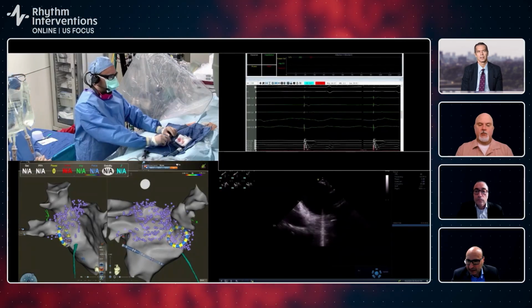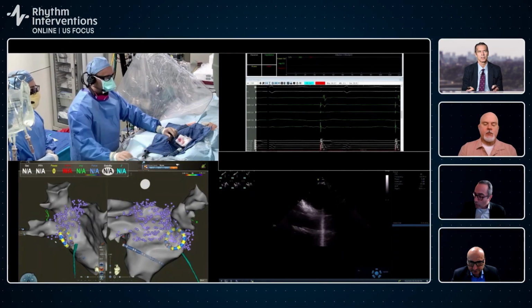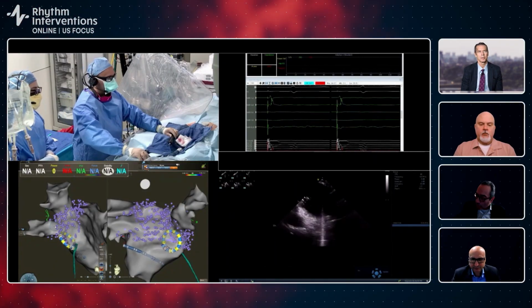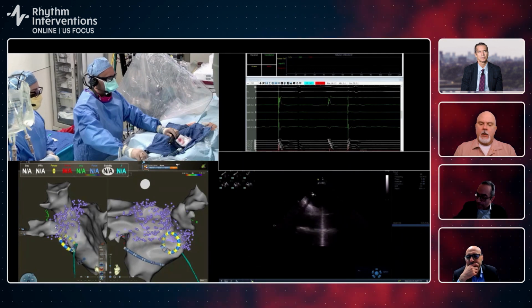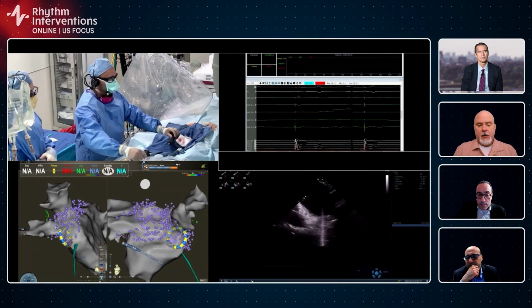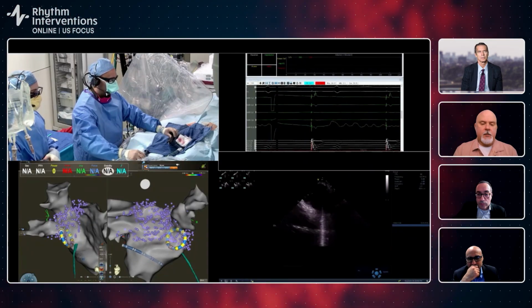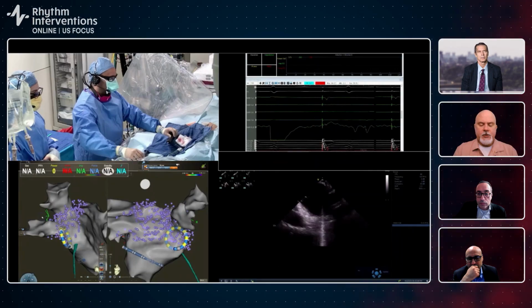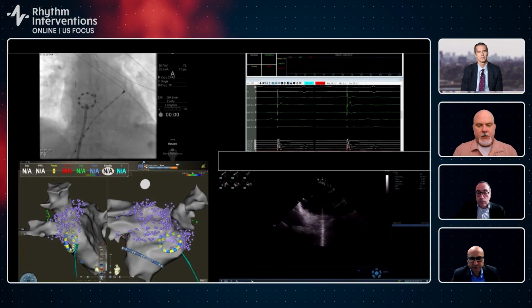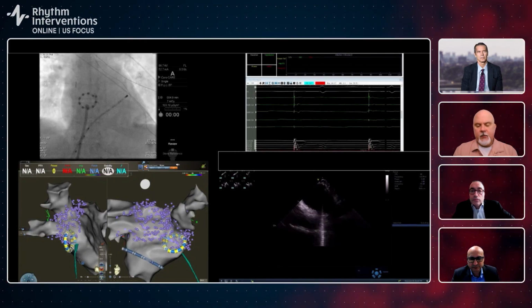In the last session, the case was done with an esophageal temperature probe, which we've never considered using for any PFA cases. Rodney, do you use a temperature probe at all for any PFA systems? No, we don't. I'll show later today that we do for radiofrequency, obviously thermal type ablations. It's not necessarily essential, but it's become kind of standard, at least in the US. But for PFA, we never have.